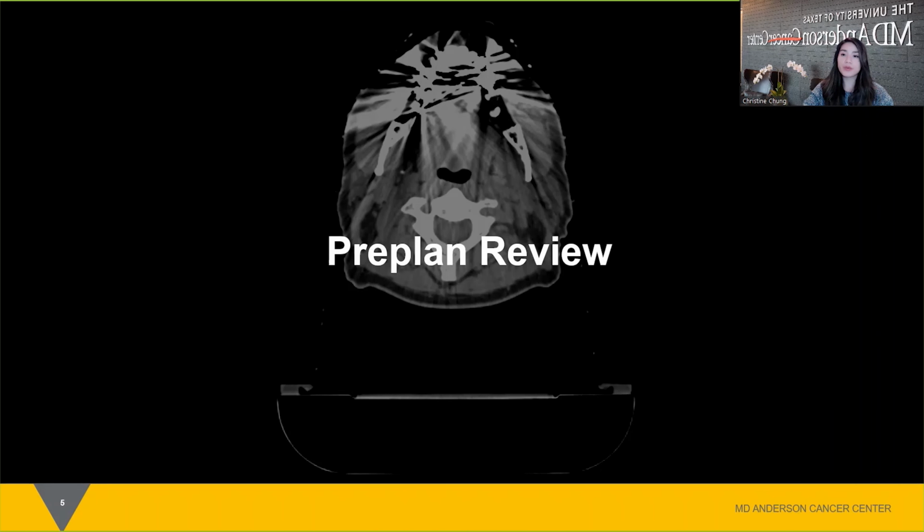Okay, so the pre-plan review will save you a lot of time further down the line. It is better to address any issues up front rather than having to replan a patient and cause treatment delays. It is important to make sure the scan and patient setup are compatible for proton planning.